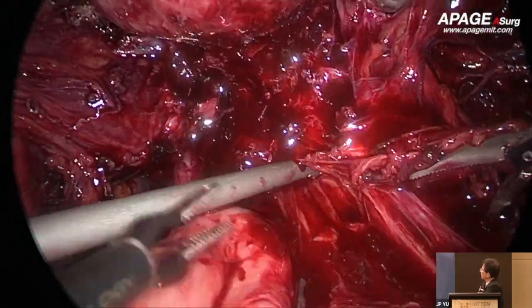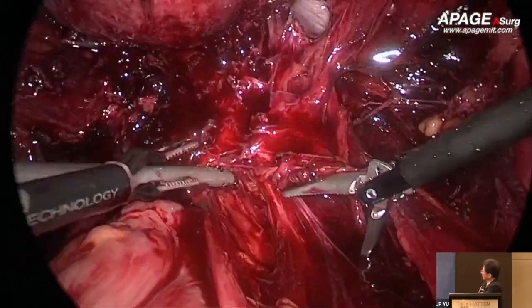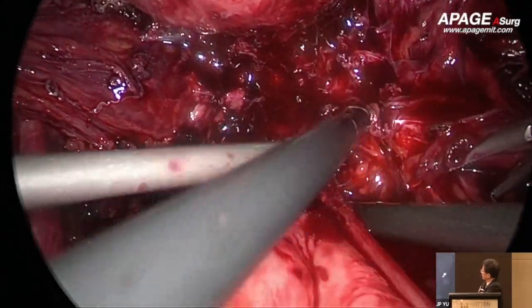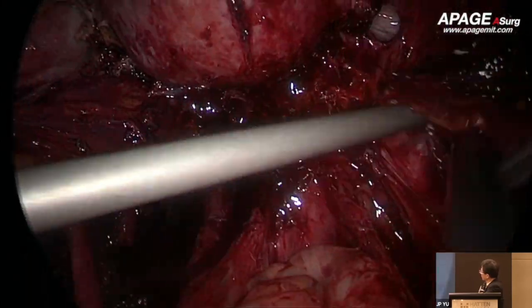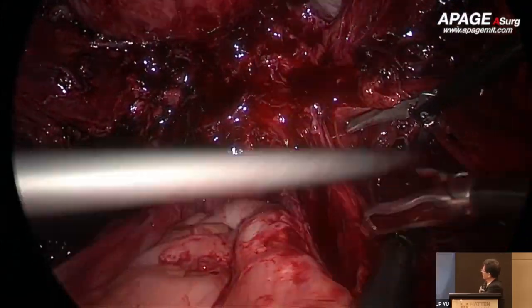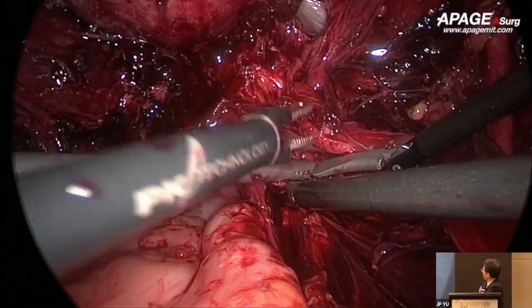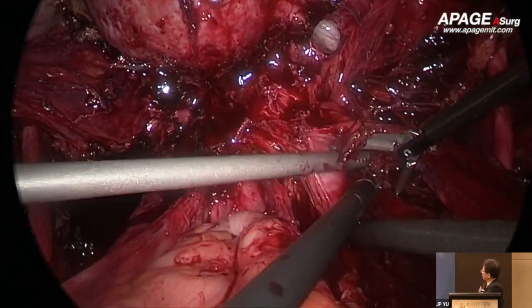So that is the reason they have the same procedure, just like doing the radical surgery. In a radical surgery, you identify the space and the ureter. In deep endometriosis surgery, it is just the same. Here the uterosacral ligament and the ureter come together. So you want to identify the uterosacral ligament and free the ureter away from it. Here we have lifted up the ureter, and the colon is still attached to the posterior lip of the cervix.